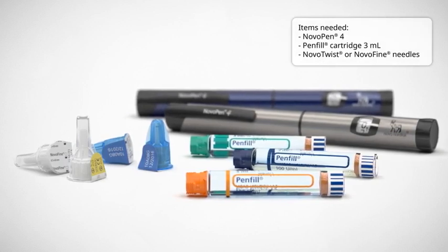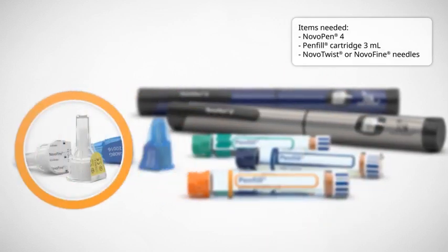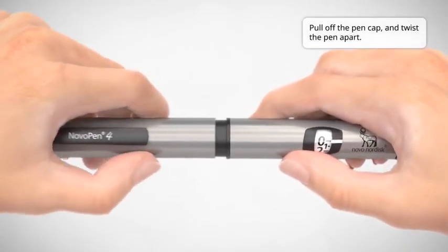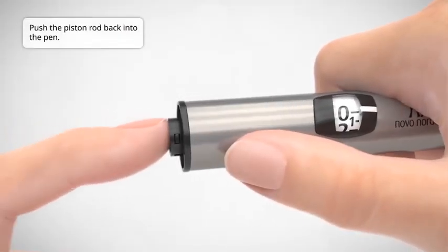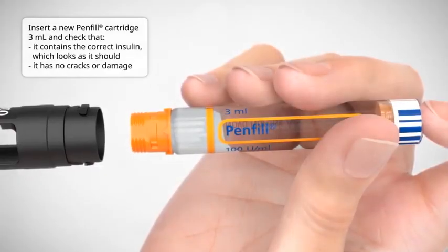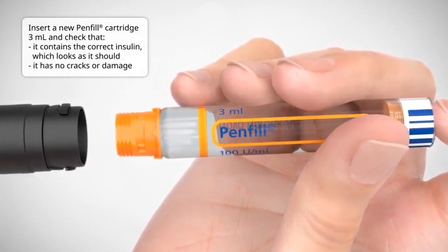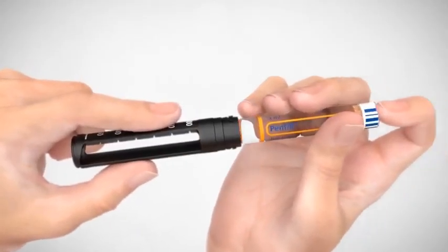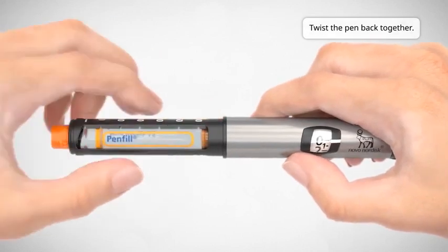NovoPen 4 is designed to be used with Pen Fill cartridge 3 ml and NovoTwist or NovoFine needles. To prepare NovoPen 4 with a new Pen Fill cartridge 3 ml, first, pull off the pen cap and twist the pen apart. If the piston rod is sticking out, push it all the way back in. Check the name and colour of the cartridge to make sure that it contains the type of insulin you need, and check that it has no cracks or damage. Insert the cartridge into the cartridge holder with the threaded end first. Push the pen back together and twist until you hear or feel a click.